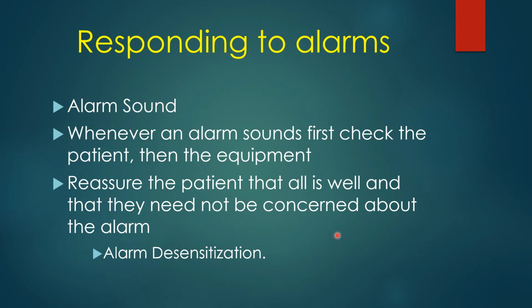Another problem with alarms is what they call alarm desensitization. You're working in an ICU, and somebody is suctioning a patient in bed 2, and the alarm starts going off. And then somebody in bed 4, they're turning the patient to his side, and he starts coughing and setting the alarm off.